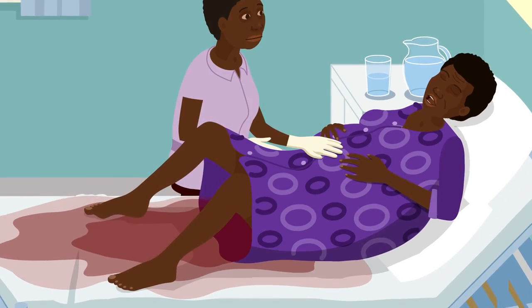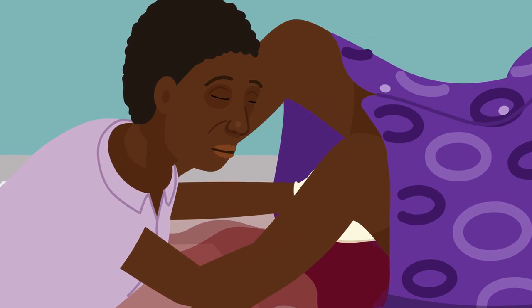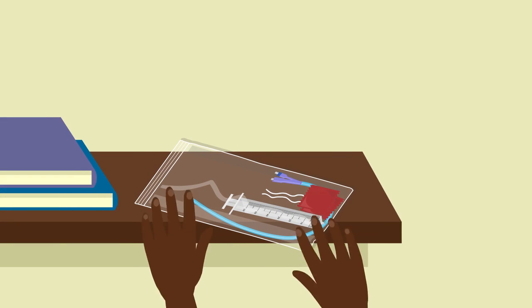Mary continues to bleed heavily. The normal methods to stop the bleeding have failed. Grace knows that Mary is losing too much blood and this is now an emergency. Grace must act quickly. She uses the UBT kit.